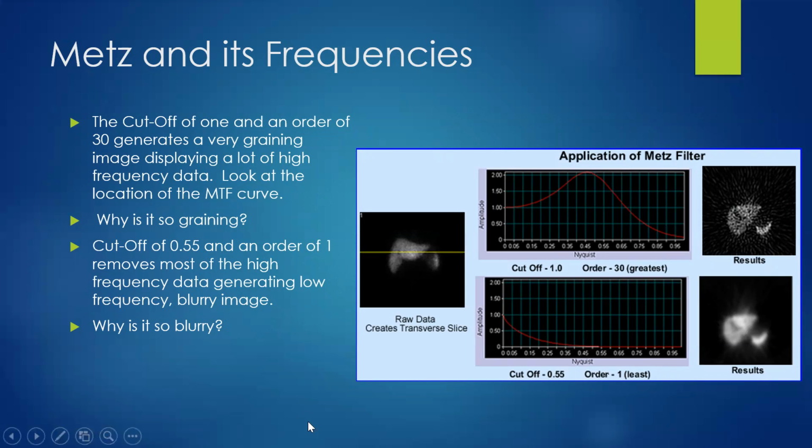And so let's look at the very first one. And again, these are extremes that I did off of a Philips system here at VCU Health Center. Here we see a lot, again, remember, smaller, larger, right? So here we got a lot of smaller objects that we're bringing into play here. Look how grainy it is. And again, we're doing a cross-sectional slice across the liver and spleen right there. Over here, we go way the opposite direction, and we're now barely seeing any, just large objects, a lot of background and so on. And what do you get? A real fuzzy image.